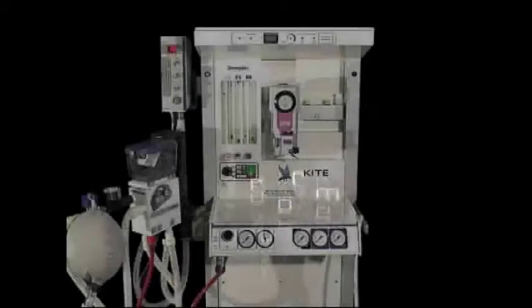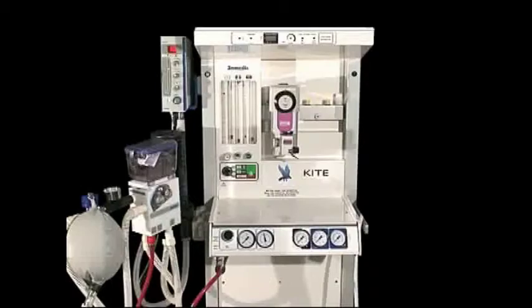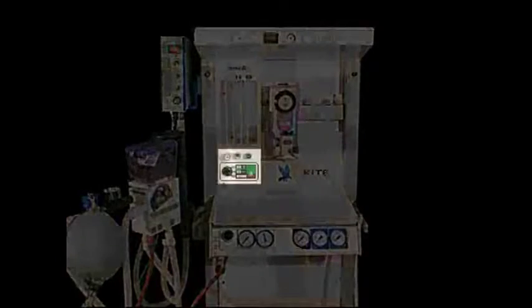Control elements. The basic components are the volume control console, the vaporizer, the manometer console, the oxygen monitor, the ventilator control, and the patient circuit with carbon dioxide absorber.